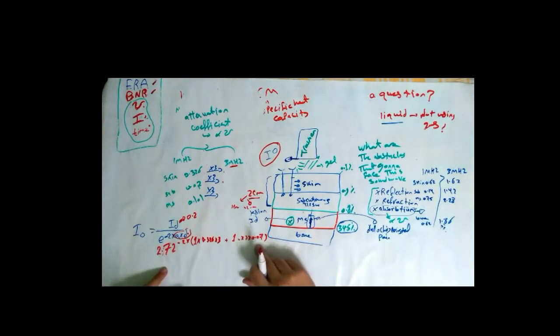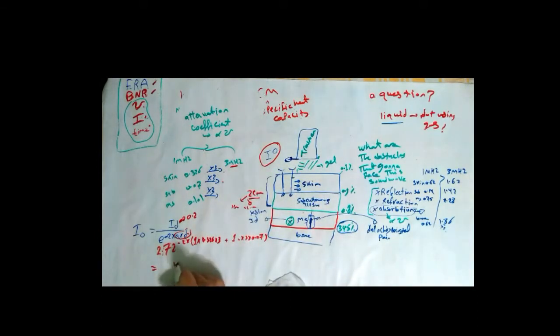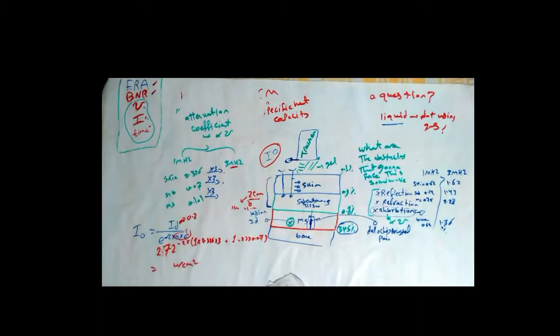Write this equation in the calculator, and your intensity at the transducer head will appear to you. And this is the intensity that you're going to set on the ultrasound device.